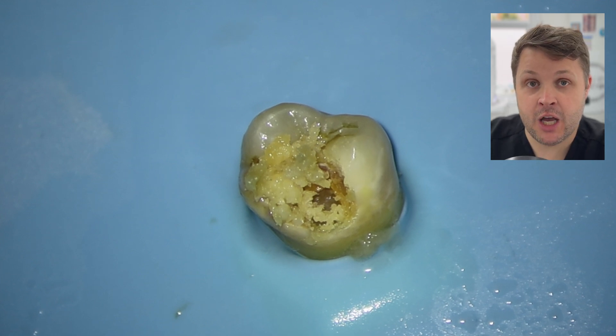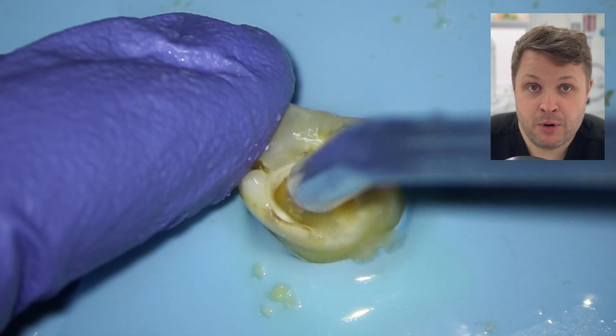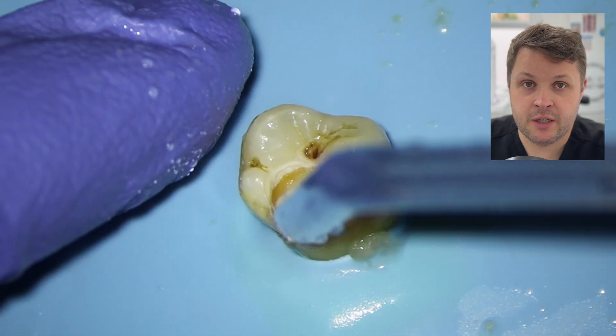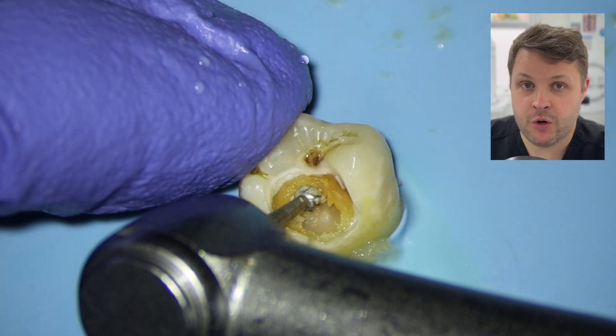Obviously what this does is it preserves as much tooth tissue as possible. What you want to do is try and preserve as much of the tooth as possible for strength. But you can see here that there's plenty left. So we're going to use just a three-in-one tip to wash the dentin away, and then we're going to go back in with the rose head.